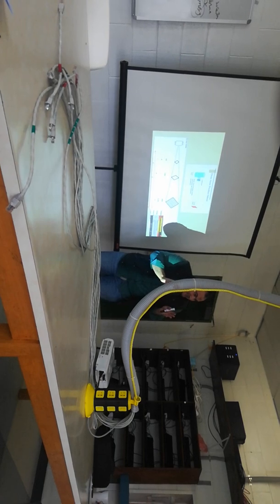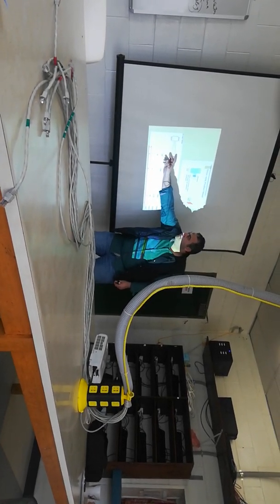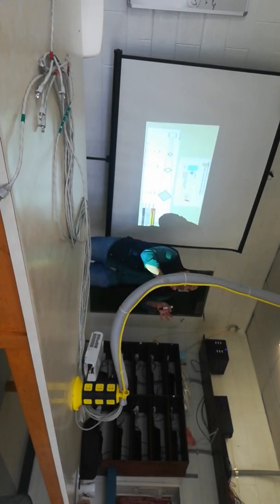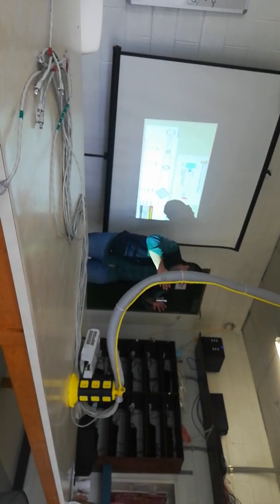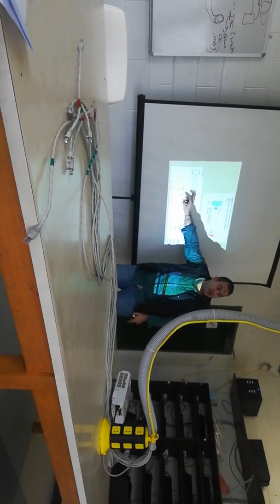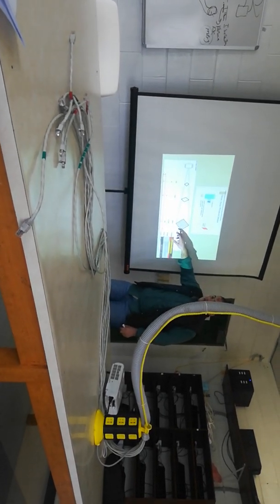The number of photons coming out from the X-ray tube in this area will be the same number here, but the concentration is different. There are differences in the concentration of photons: here highly concentrated, here less concentrated, here very low concentration.